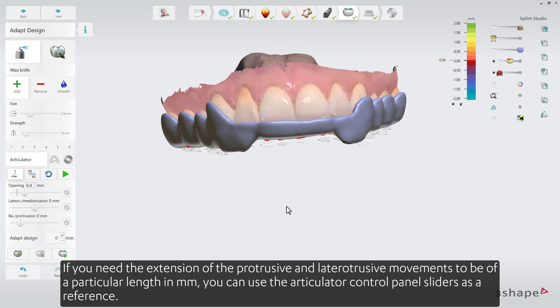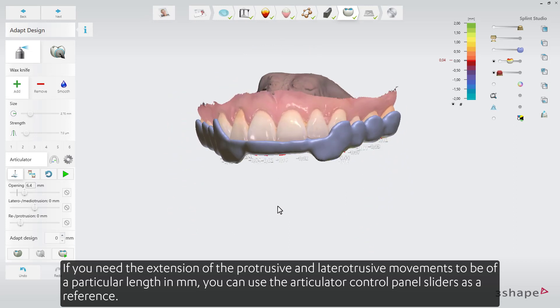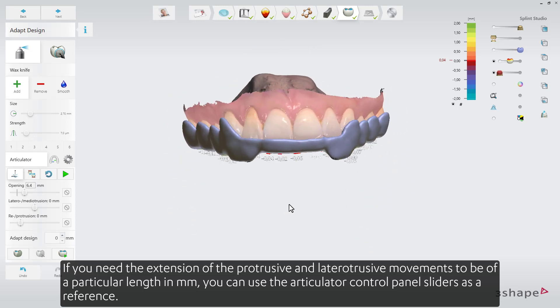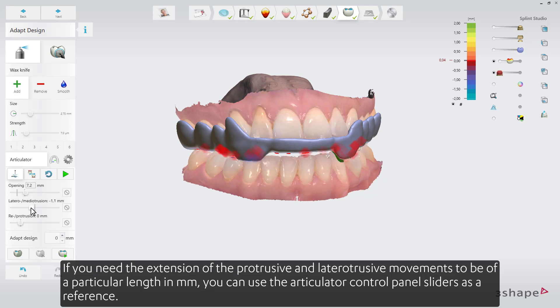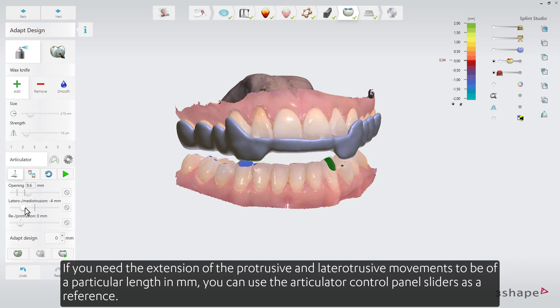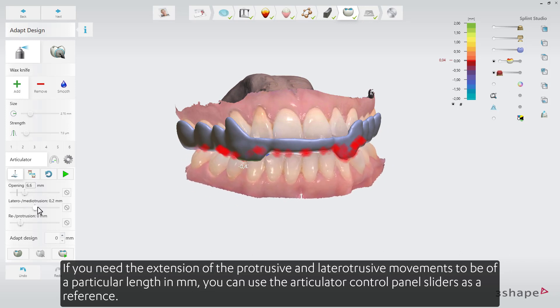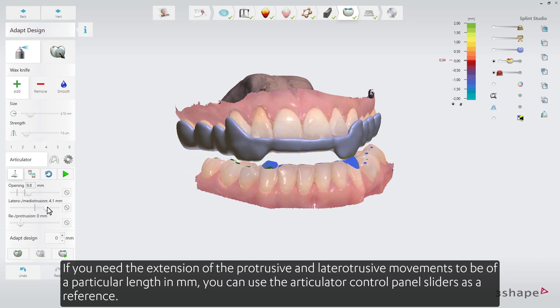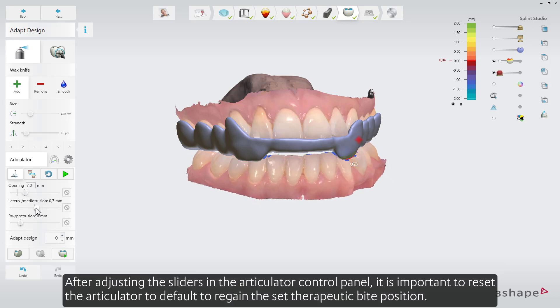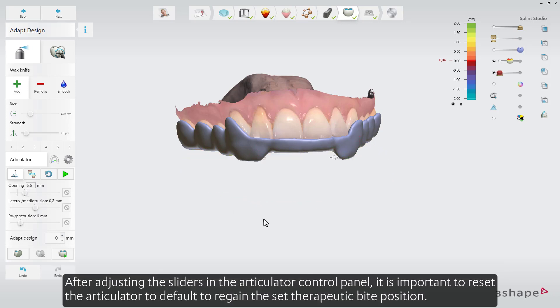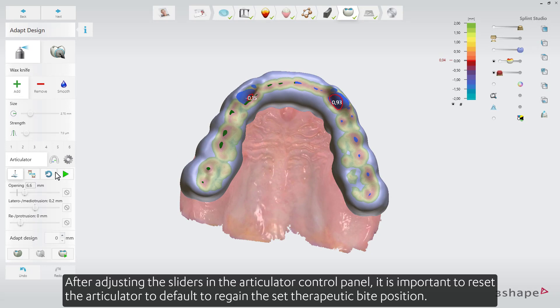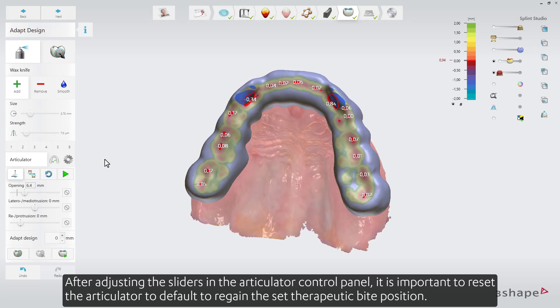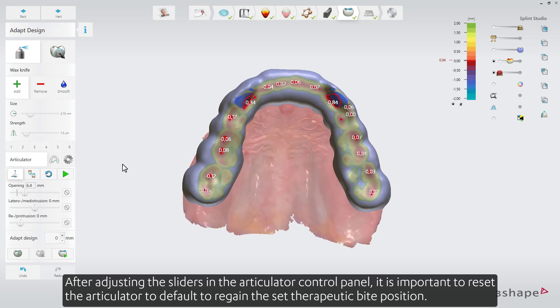If you need the extension of the protrusive and lateral intrusive movements to be of a particular length in millimeters, you can use the Articulator control panel sliders as a reference. After adjusting the sliders, it's important to reset the Articulator to default to regain the set therapeutic bite position.